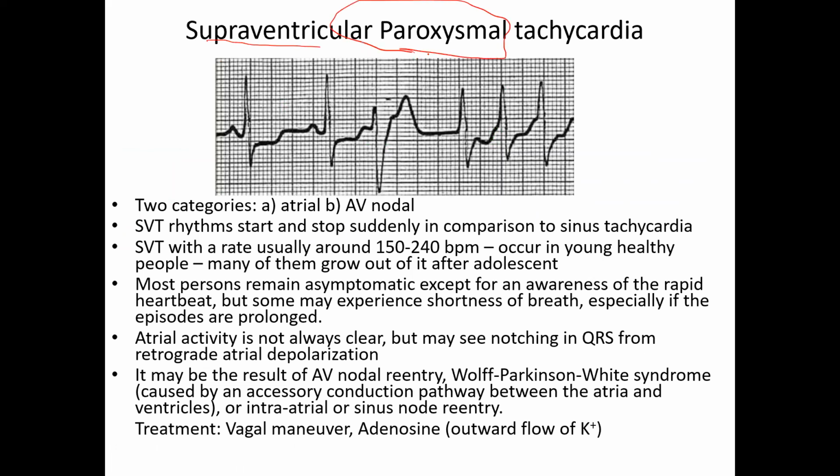Paroxysmal means sudden. Like all of a sudden you have a relatively, this is ST depression, but you have a normal PQRS, then suddenly you get this ventricular beat, right? Everybody agree this is a wide beat. It's a wide QRS. And it comes out of nowhere, and then it starts up again, back to what it was before.